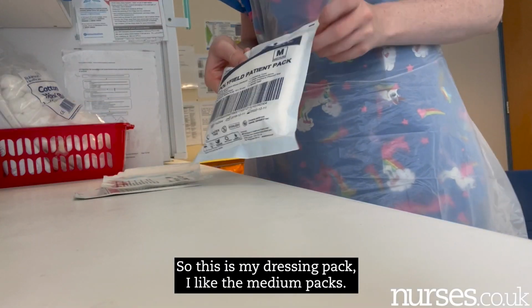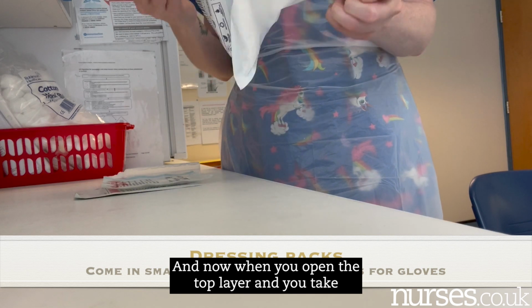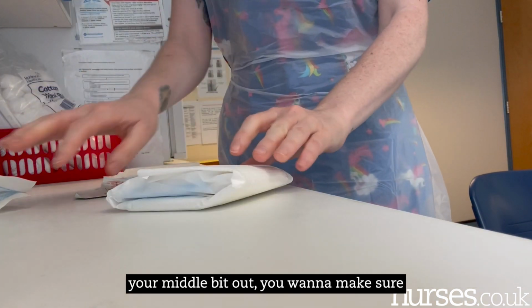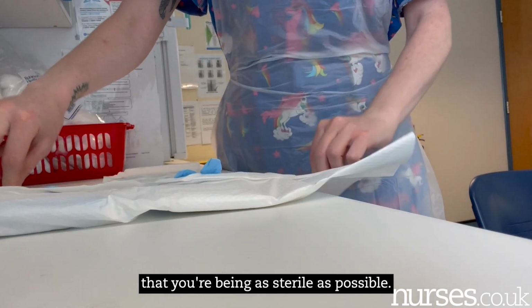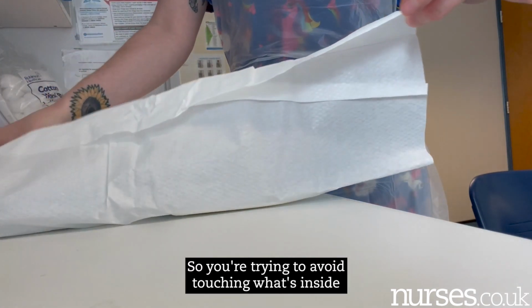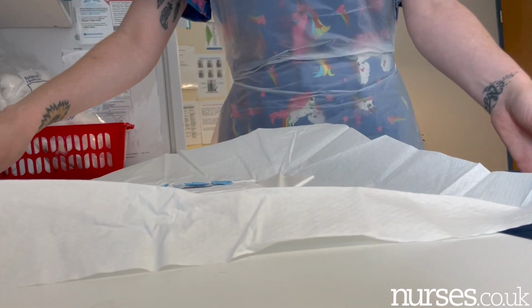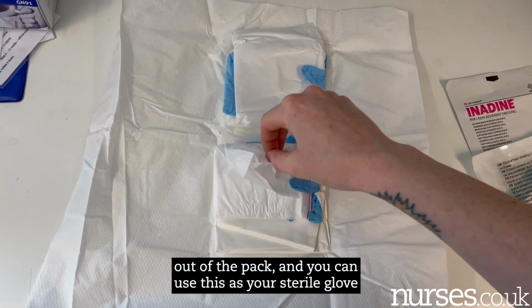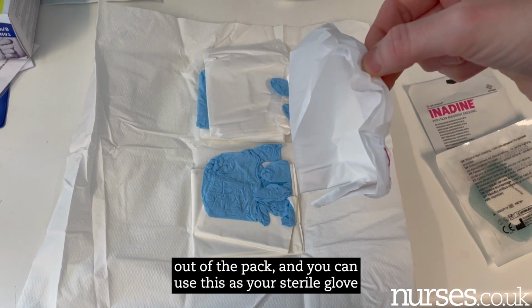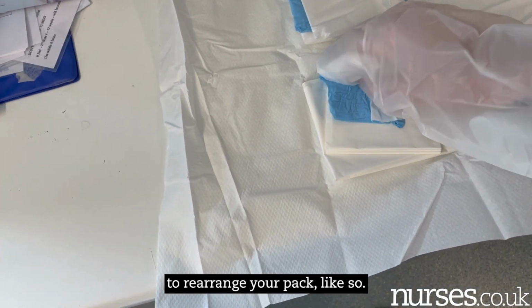So this is my dressing pack. I like the medium packs. Now when you open the top layer and you take your middle bit out, you want to make sure that when you're opening this layer you're being as sterile as possible. So you're trying to avoid touching what's inside this white paper that I'm unfolding now. And then you'll just take your little white bag out of the pack, and you can use this as your sterile glove to rearrange your pack, like so.